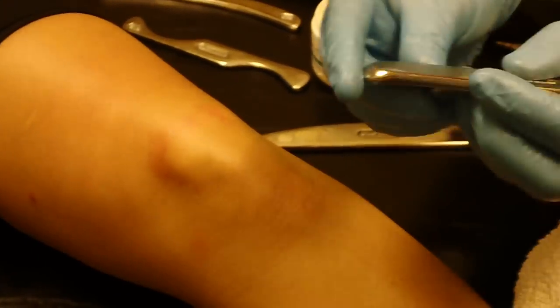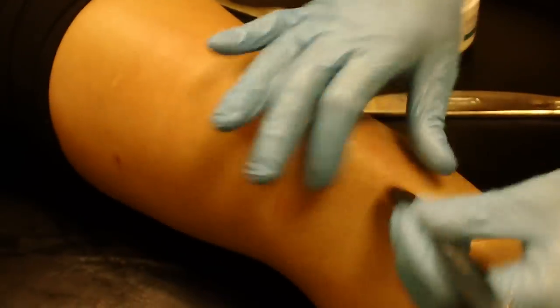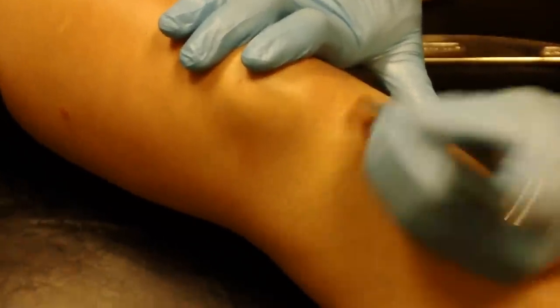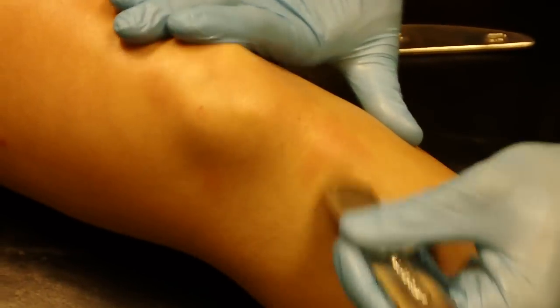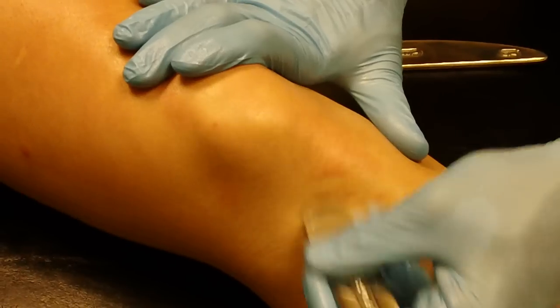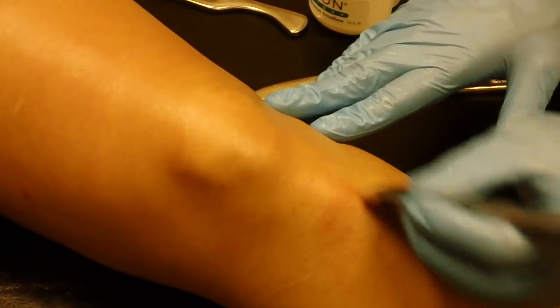And then finally, if I want to get really focused, I can use the GT3. This instrument can be held almost like a pencil and work right at the area that's giving us the most trouble. This instrument is great when we're working on focused areas — areas of the hand, areas of the foot, or even to frame around areas like the tibial tubercle.